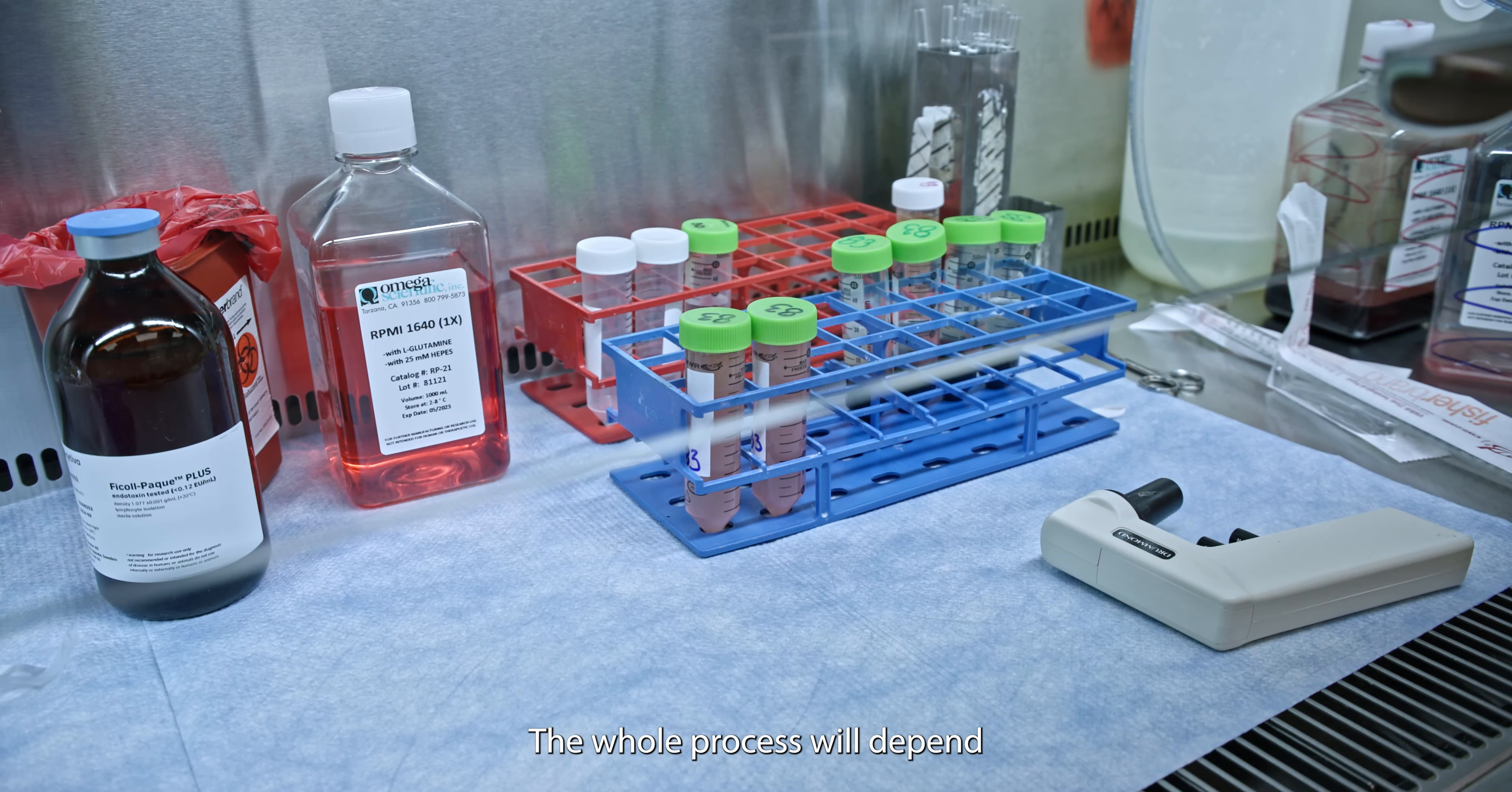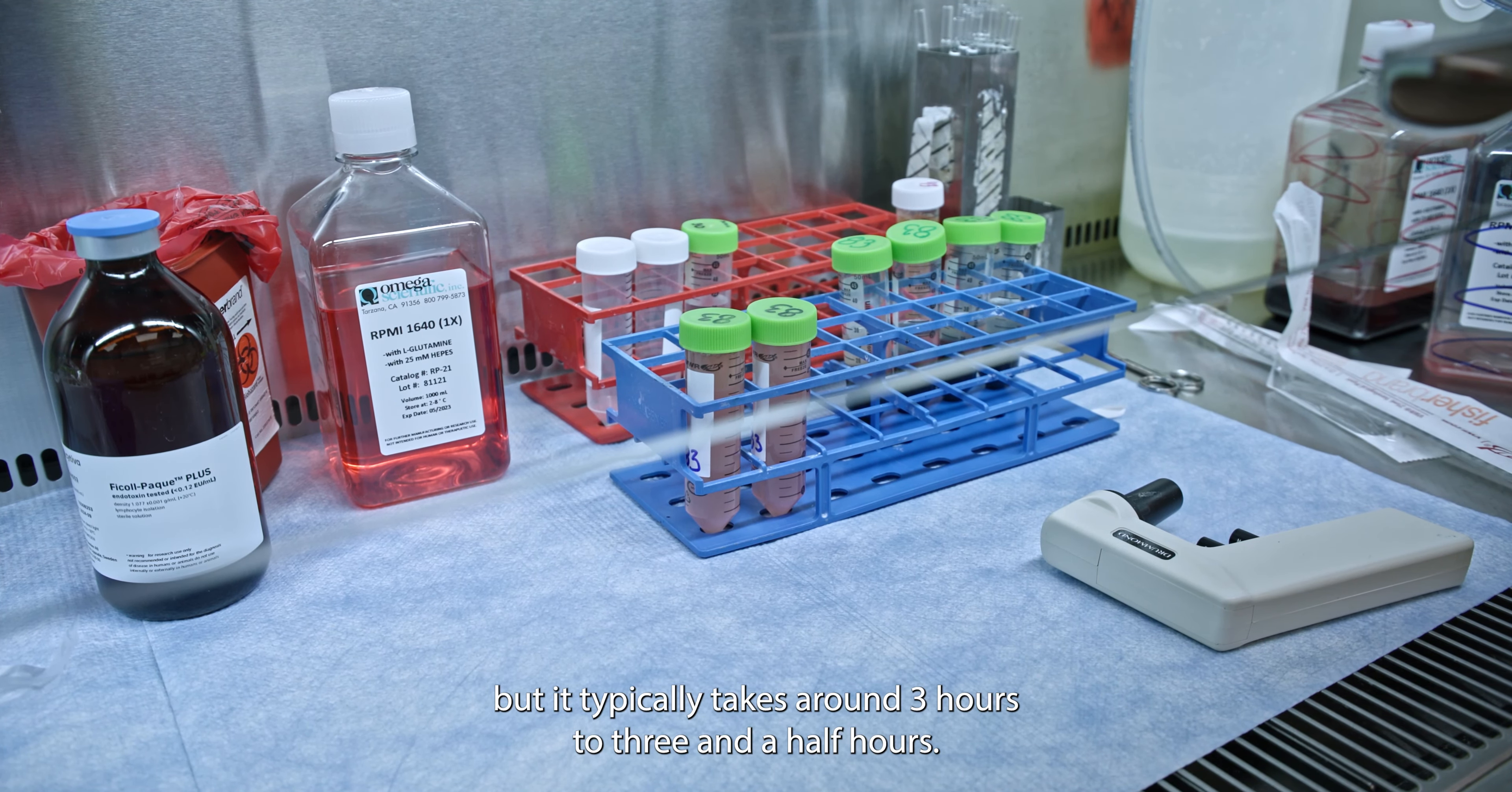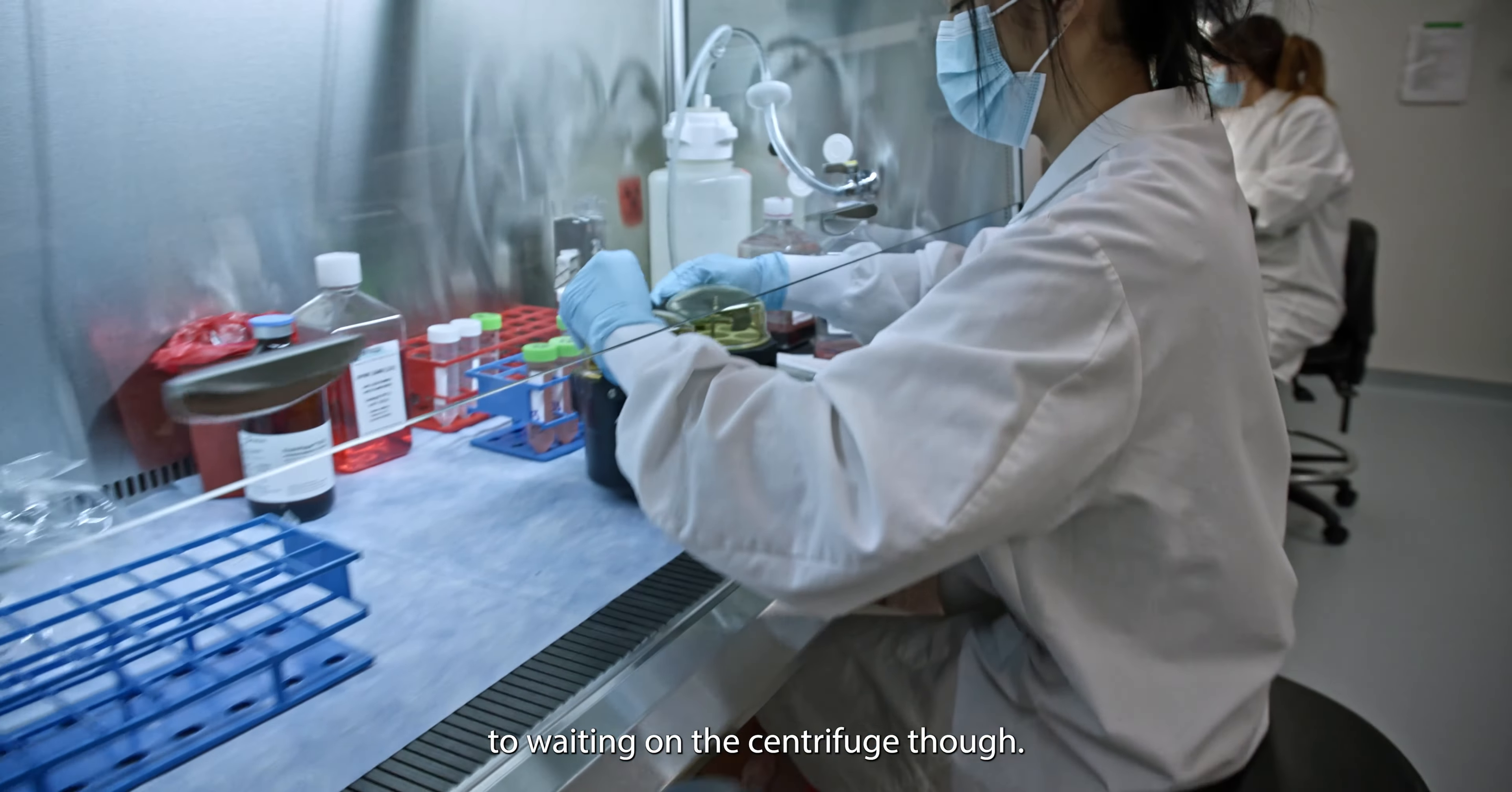The whole process will depend on the volume we start with, but it typically takes around three hours to three and a half hours. Most of the time is due to waiting on the centrifuge, though.